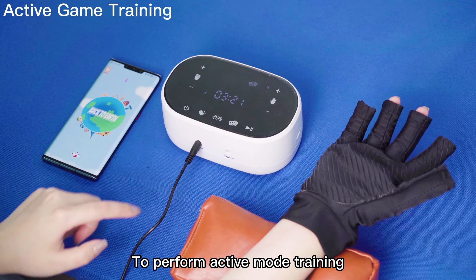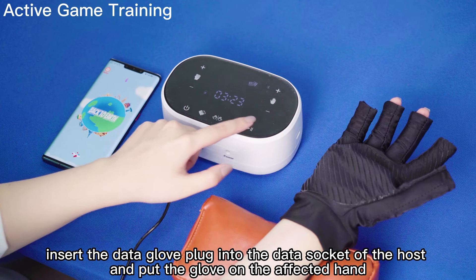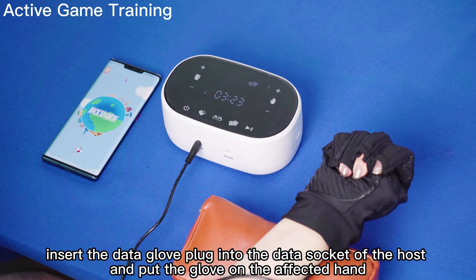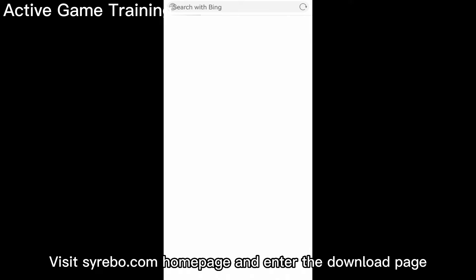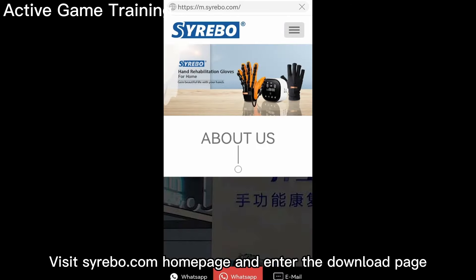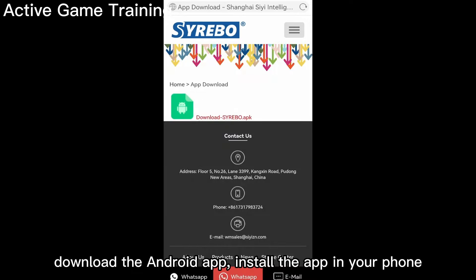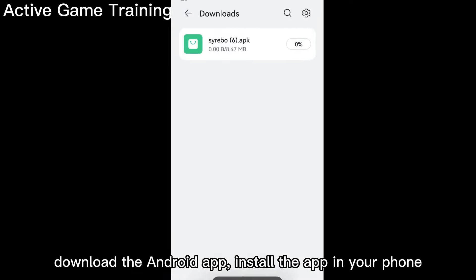To perform active mode training, insert the data glove plug into the data socket of the host and put the glove on the affected hand. Visit siribo.com and go to the download page. Download the Android app and install it on your phone.